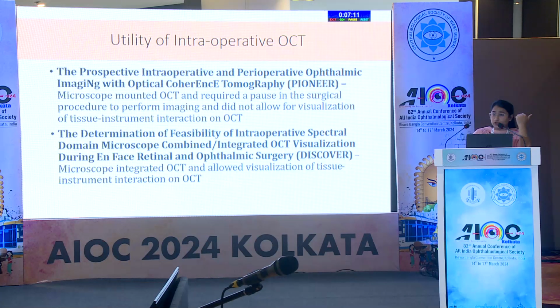And the utility of intraop OCT was given to us by 2 landmark studies that were the Pioneer study and the Discover study. The difference in these 2 studies was that the Pioneer study used a microscope mounted OCT. As I mentioned before, that meant that there was a pause during surgery, which was roughly around 6 minutes per surgery. And because there was a pause, we could not understand the tissue and instrument interaction on OCT.